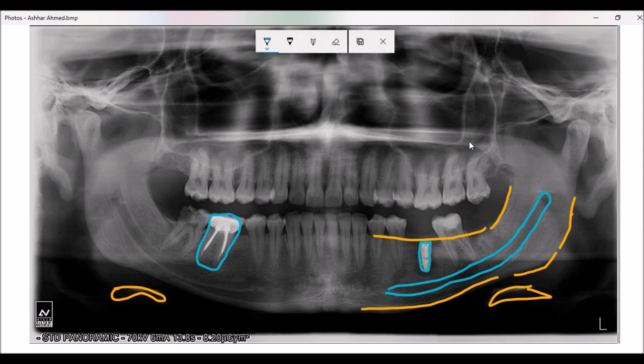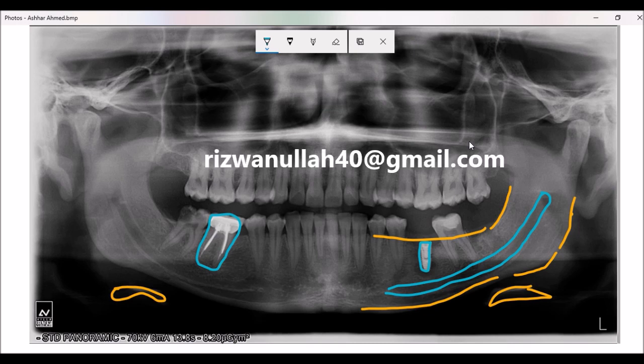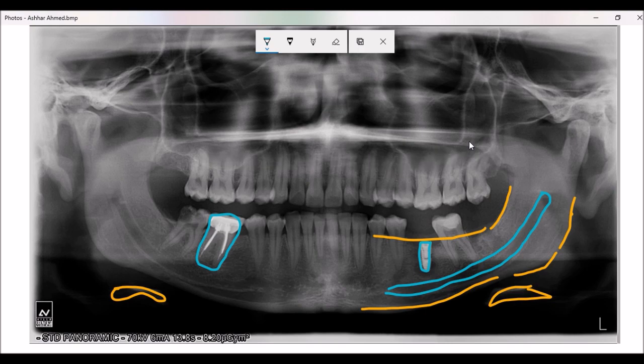There are a number of other landmarks on a panoramic radiograph, but here I have only explained those that are very prominent. Please do give me feedback either as a comment, a like, or a dislike. You can also email me at the address appearing on the screen. Thank you very much for watching.